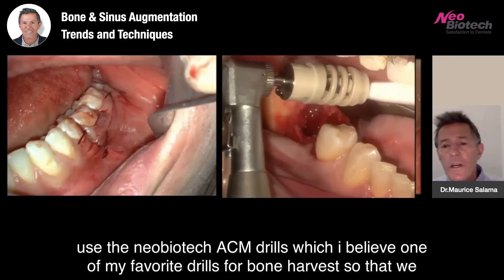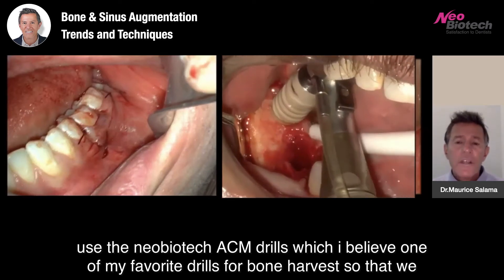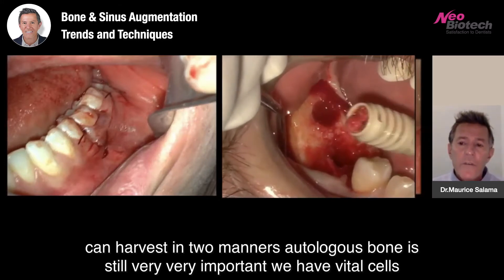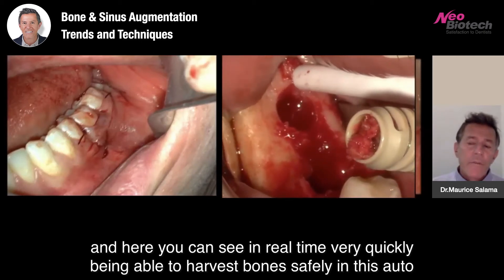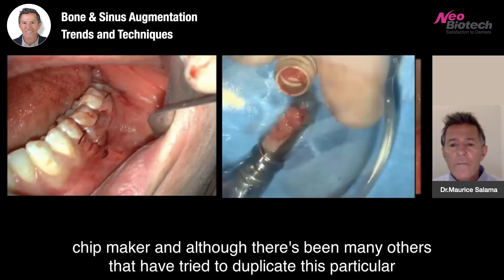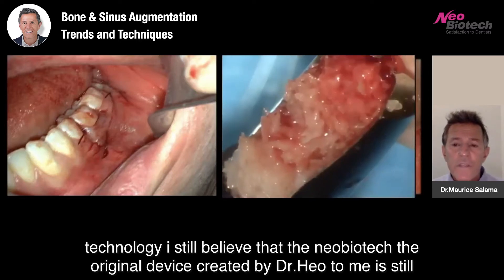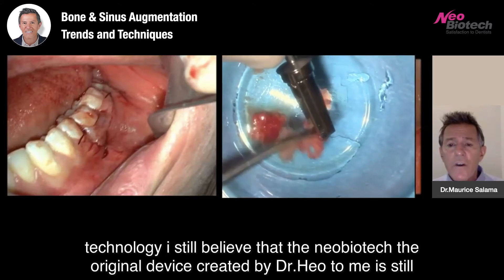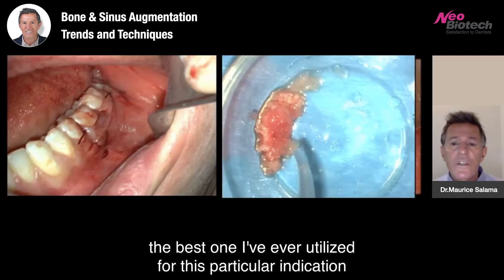We can also use the Neobiotech ACM drills, which I believe are one of my favorite drills for bone harvest, so that we can harvest in two manners. Autologous bone is still very, very important — we have vital cells. And here you can see in real time, very quickly being able to harvest bone safely in this auto chip maker. Although there have been many others that have tried to duplicate this particular technology, I still believe that the Neobiotech — the original device created by Dr. Heo — is still the best one I've ever utilized for this particular indication.